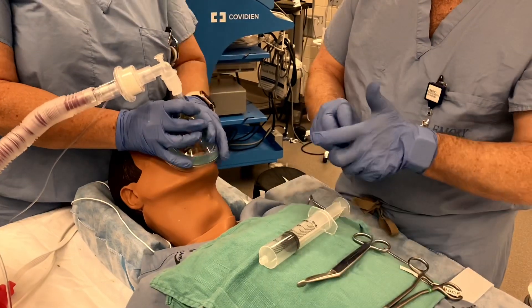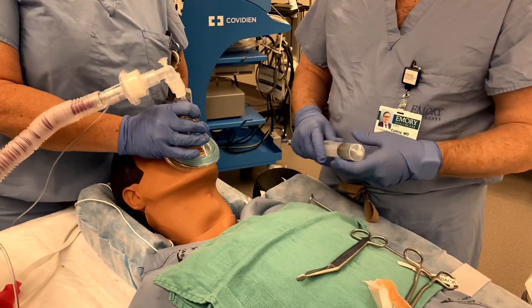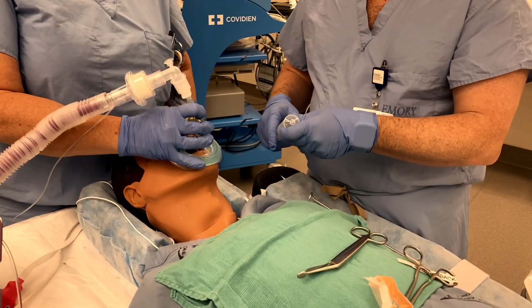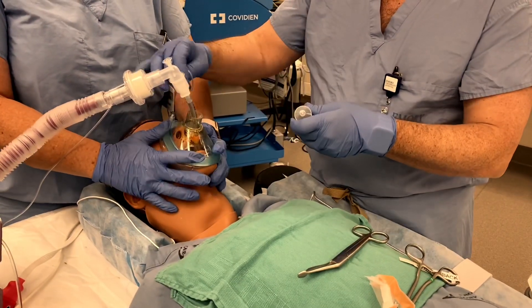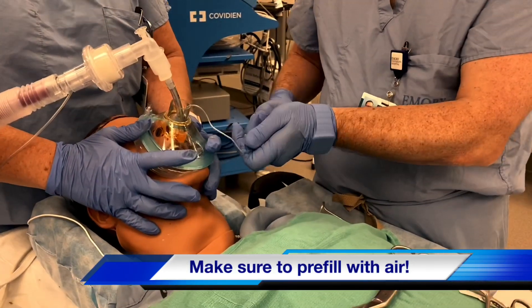Now, as the rest of the last few minutes of the case finish, one person is dedicated to holding the tube in place. As your patient meets extubation criteria, you and your partner will be there together. One person will hold the mask and your colleague will hold both the tube and the syringe.